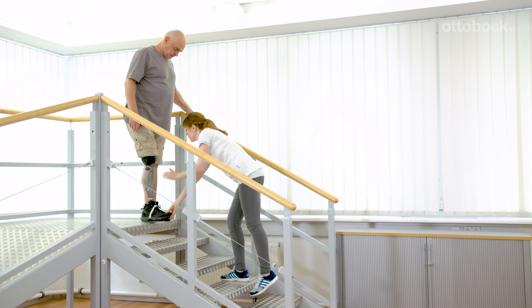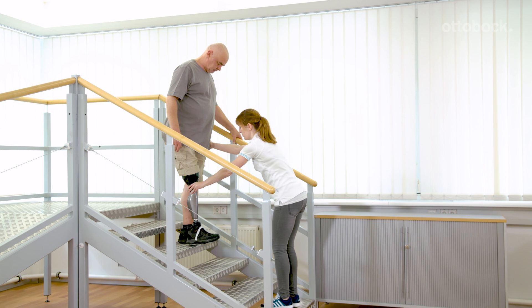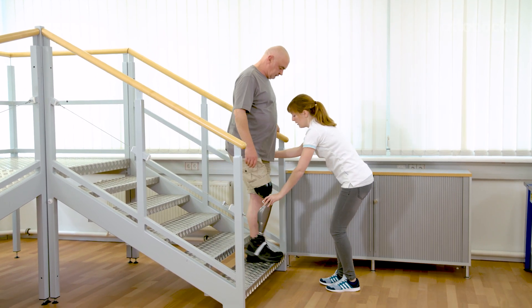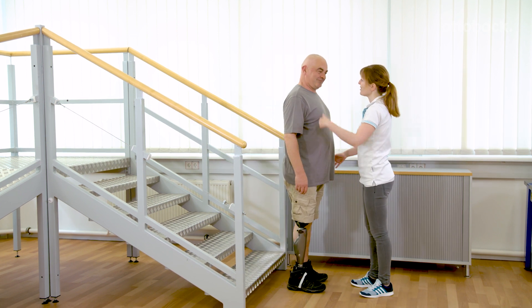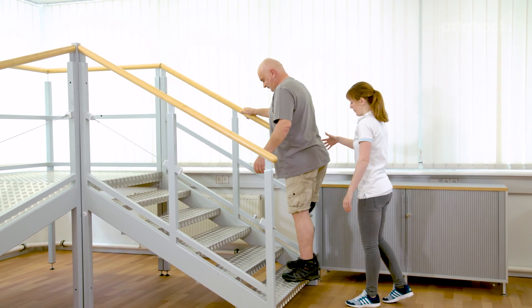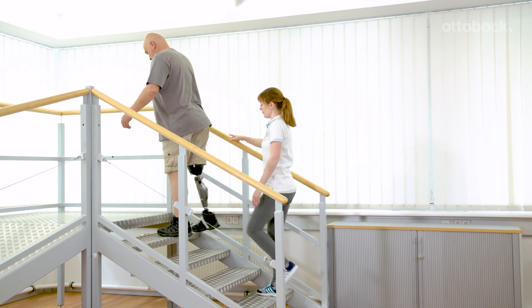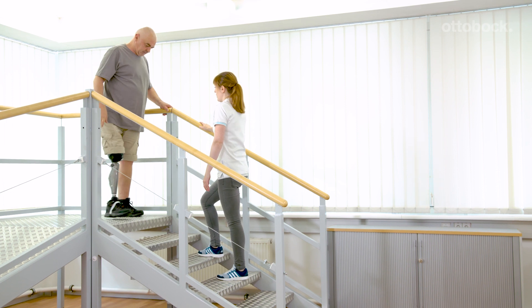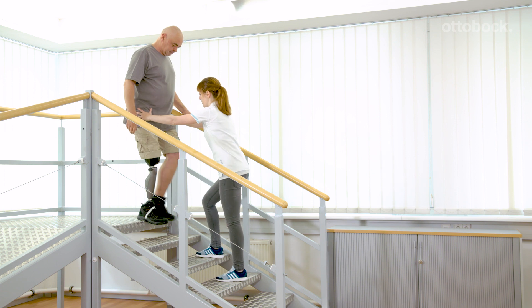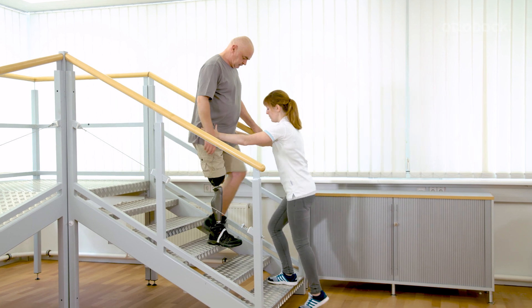The movement pattern will be repeated with a larger number of steps. Franziska supports knee flexion only if necessary. She feels if Gerhard allows knee flexion and loads the prosthetic knee. Franziska supports Gerhard at the pelvis. She can initiate the weight shift, control the direction of movement, and correct the rotation of the hip.